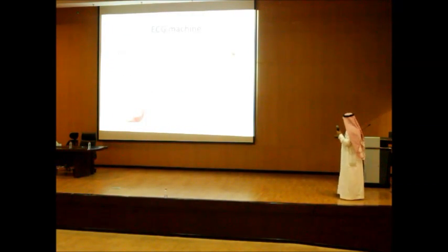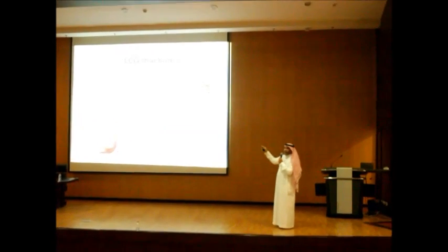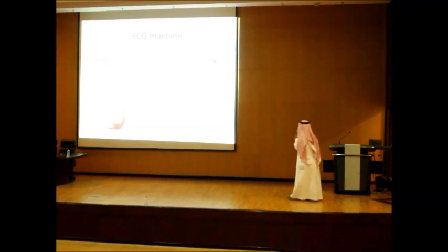Definitely, so what is the ECG? Simply, ECG is a recording on a paper of the electrical activity of the heart. Whatever goes on in the heart is transmitted through wires into that machine, and that machine translates this electrical activity onto a paper that is moving. And it shows the electrical activity of the heart.